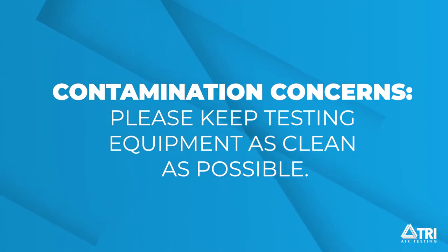The input fitting and filter union assembly have been disinfected to remove mold and bacteria contamination, assembled and sealed in a plastic bag to prevent contamination during shipment. Please make sure that when you handle these parts you don't introduce them to sources of contamination other than the source air that you are testing.